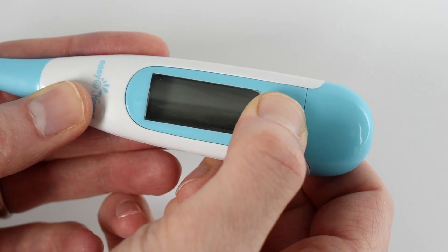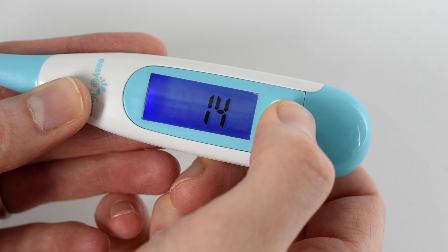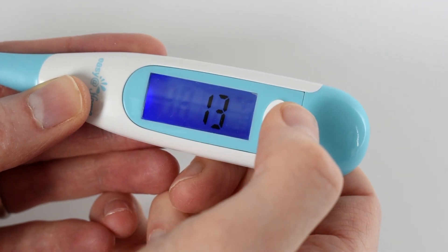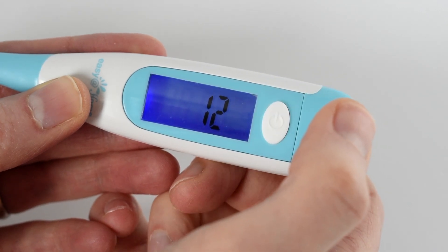While the thermometer is off, press and hold the on-off button for about four seconds to enter the memory recall mode. Briefly press the on-off button to scroll through each saved temperature starting from the most recent one.